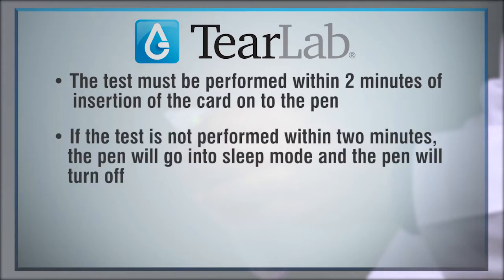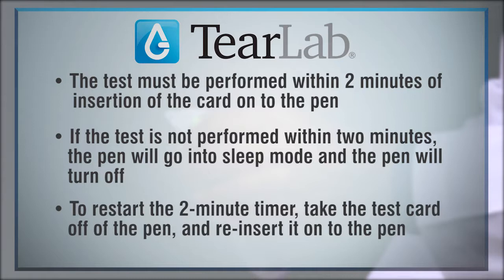The test must be performed within two minutes of insertion of the card onto the pen. If the test is not performed within two minutes, the pen will go into sleep mode and turn off. To restart the two-minute timer, take the test card off of the pen and reinsert it onto the pen.